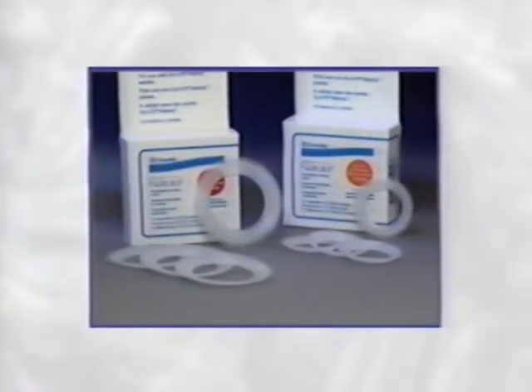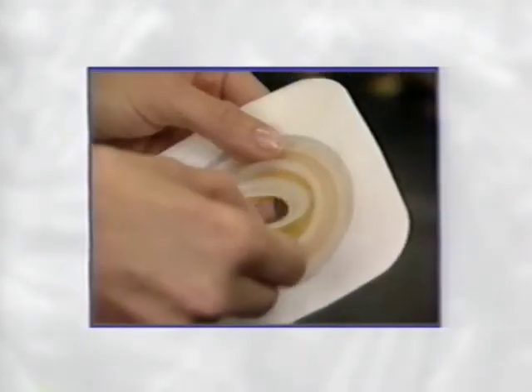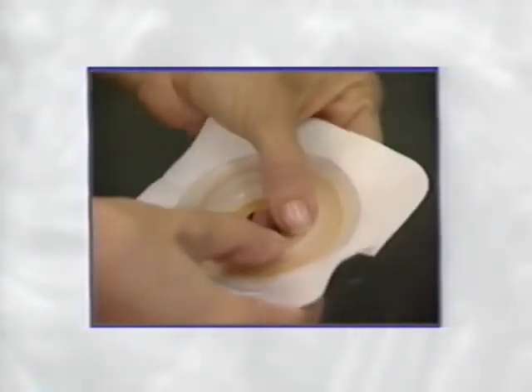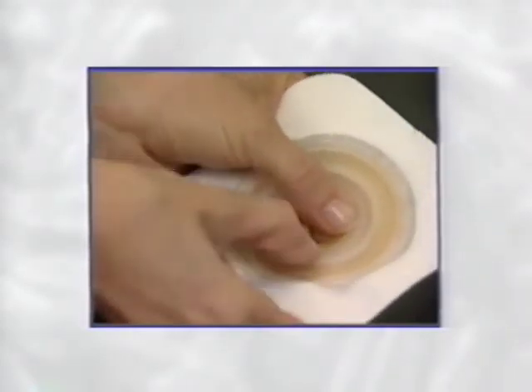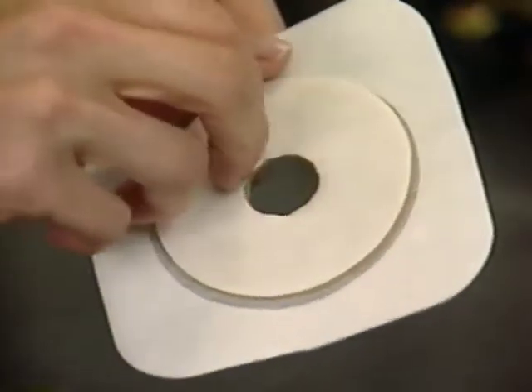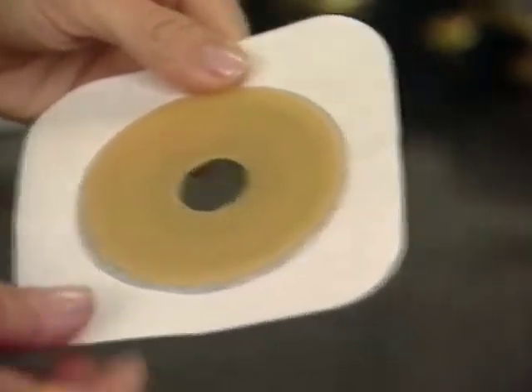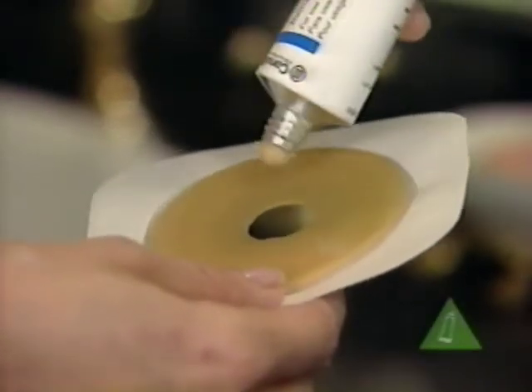If your stoma is flush or retracted, your healthcare professional may recommend using a disposable convex insert with your flexible wafer. This is a simple process. Choose an insert at least 1/4 inch larger than the widest part of your stoma. Press the convex insert firmly into the flange. Now, remove the release paper from the barrier. For now, do not remove the release paper from the tape collar.